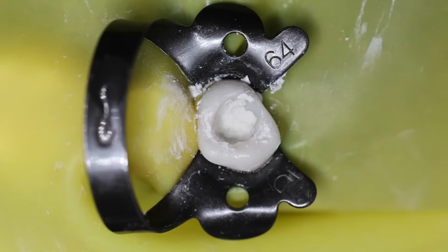In that case we can just use the composite instruments so that we can proceed with the composite restorations. So just a minute doctor, I'm just looking for that thing. Okay, yes, I got it. So we are just using the applicator tips to apply the bonding agent.